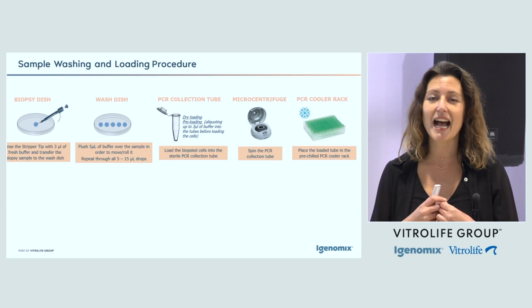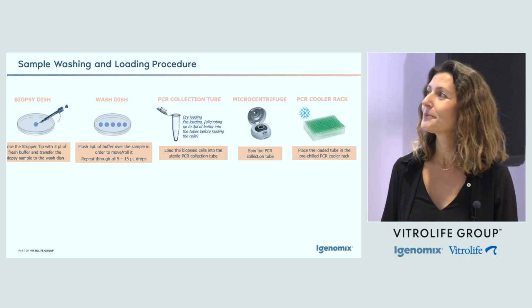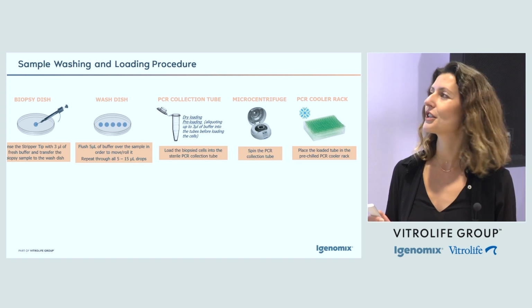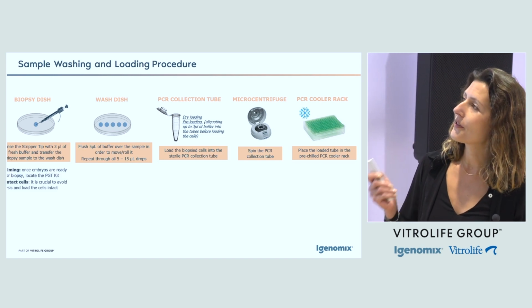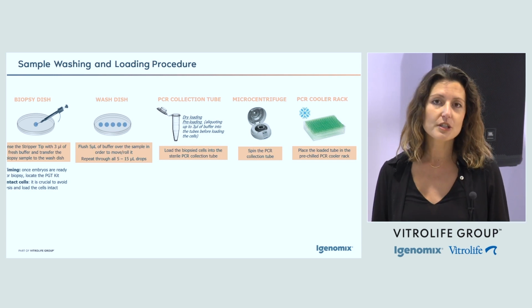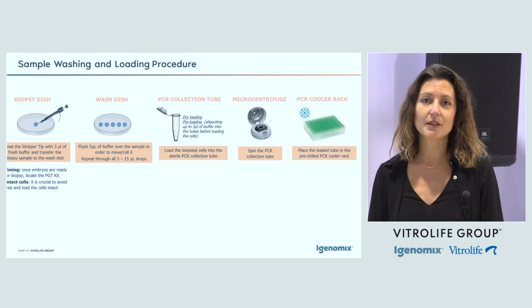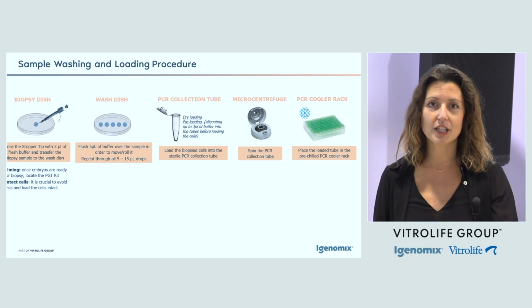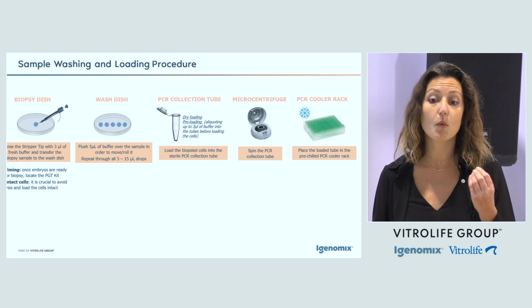And I think that absolutely applies for this protocol, because there are some details that are going to have a big impact on your results. So for example, for the first step, one of the recommendations that we have in the protocol is, before you start with the biopsy and you have the embryos out, you know that the faster that you work is the better, not only for the embryos, but also for the biopsies. Why?